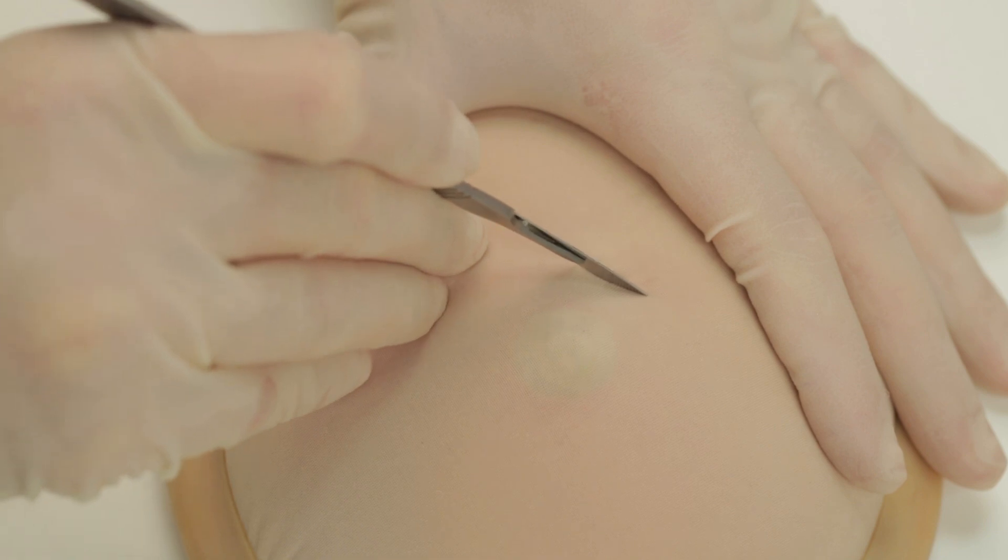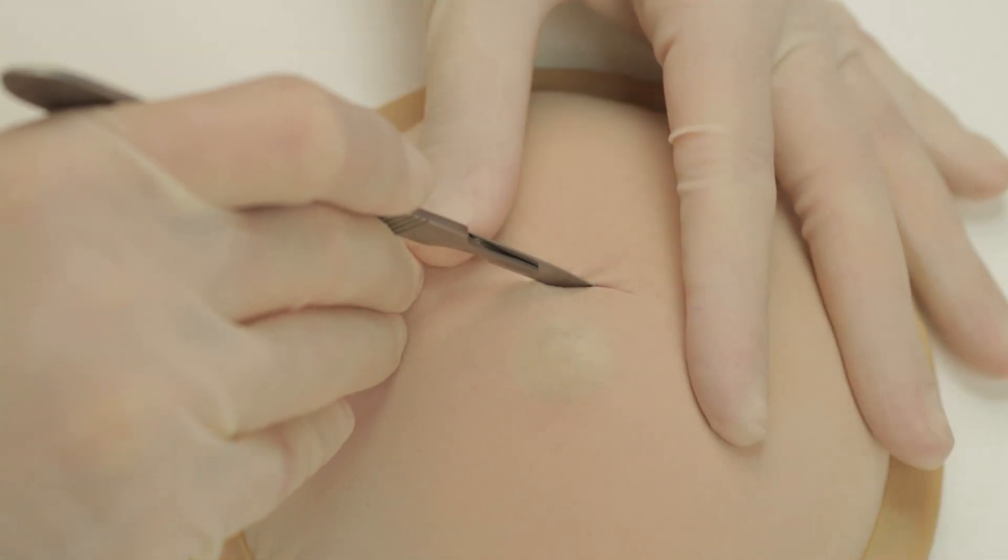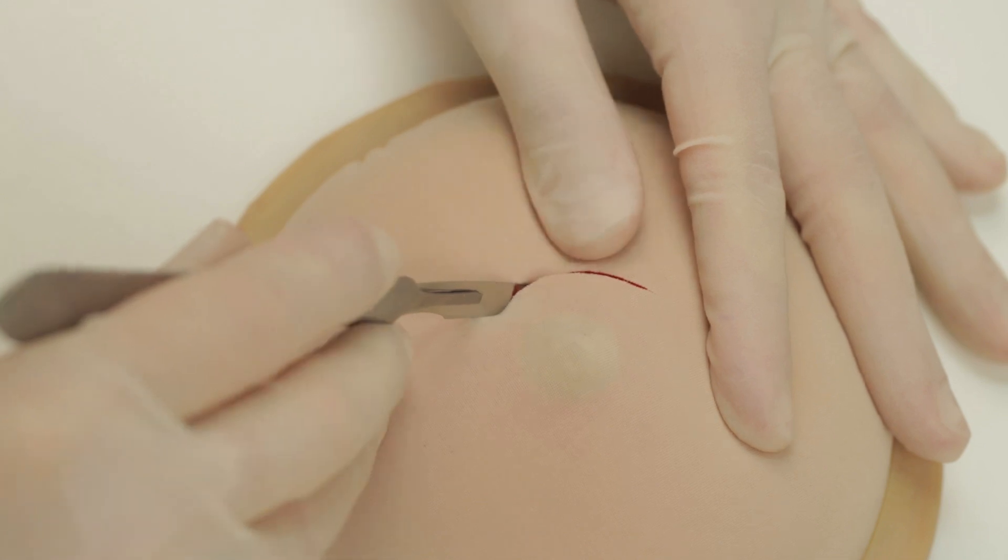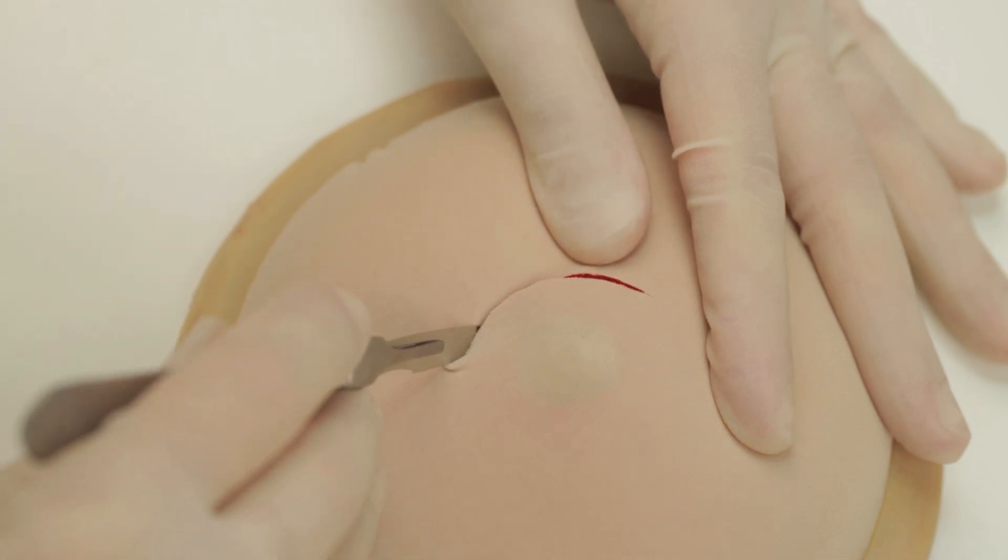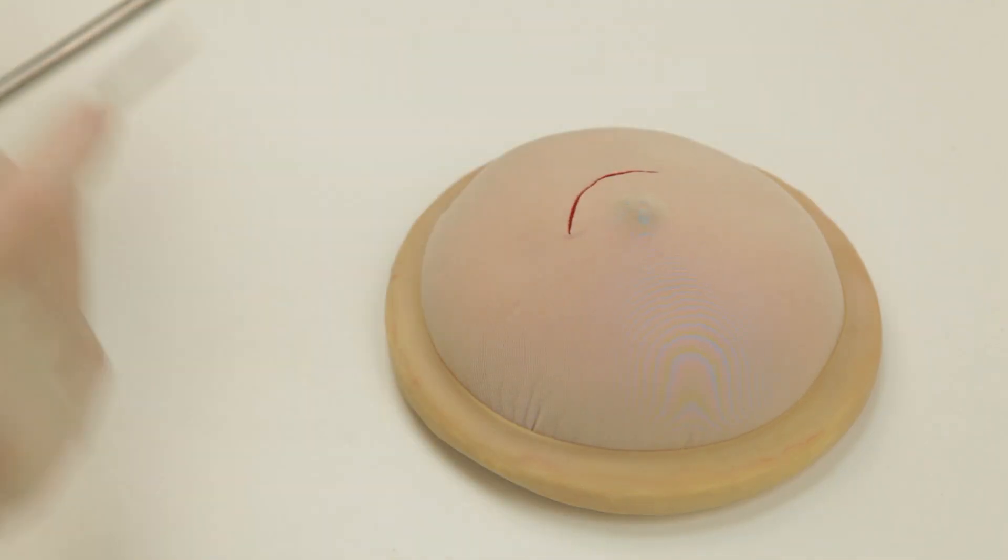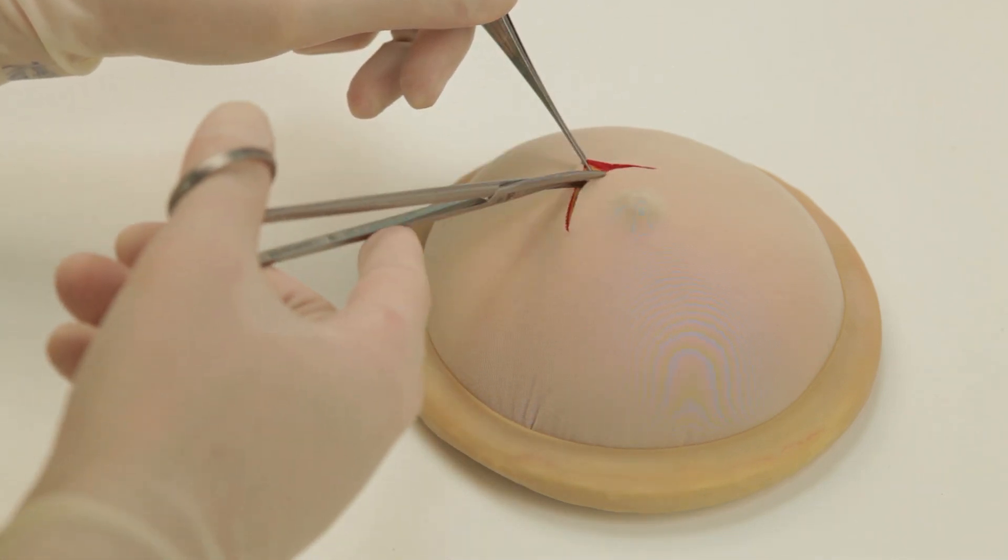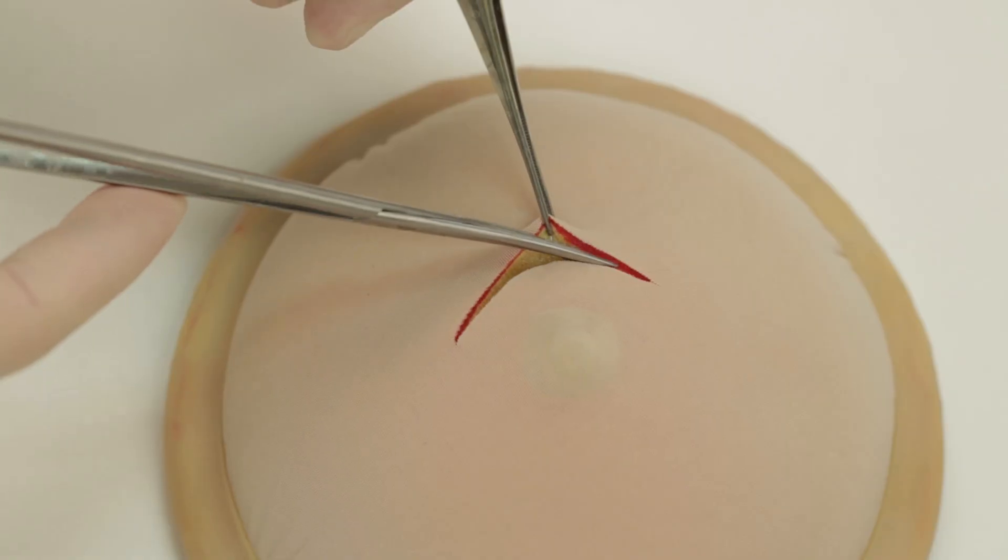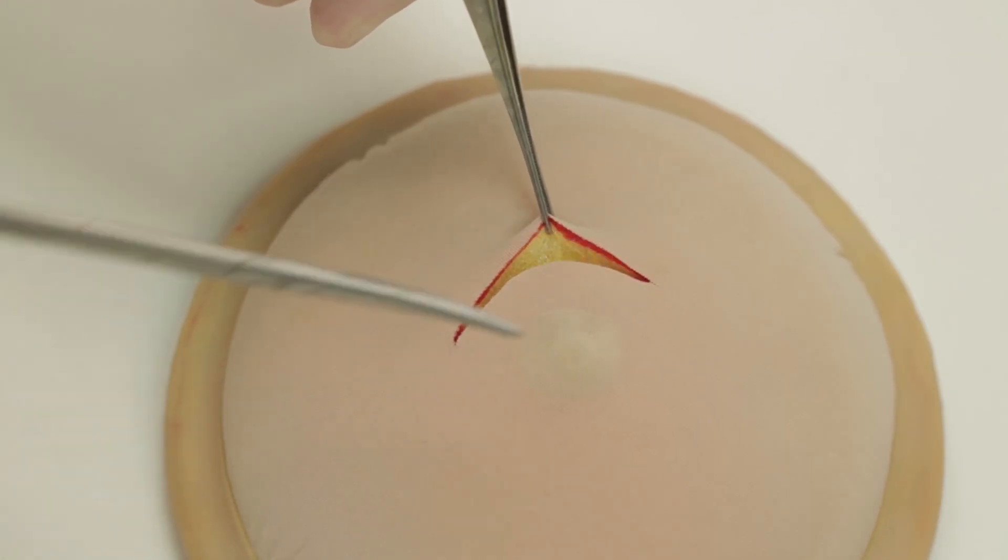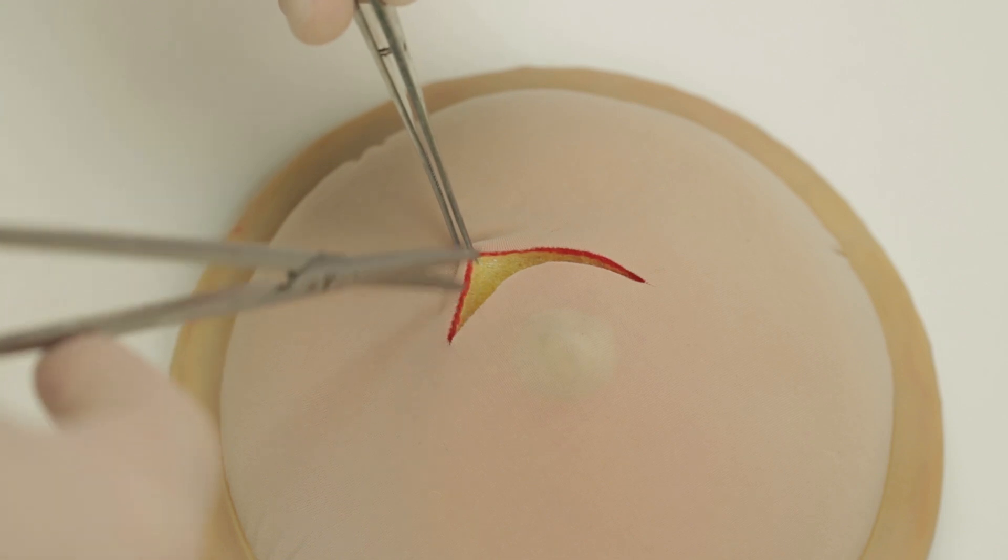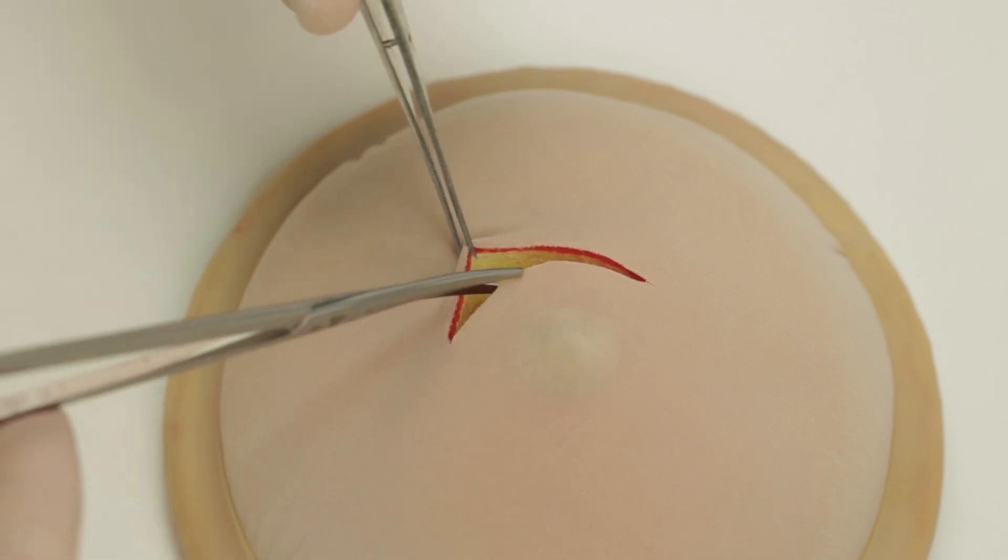In this case, we are using a periareola incision. Deepen the incision through the subcutaneous tissues, working towards the lesion.